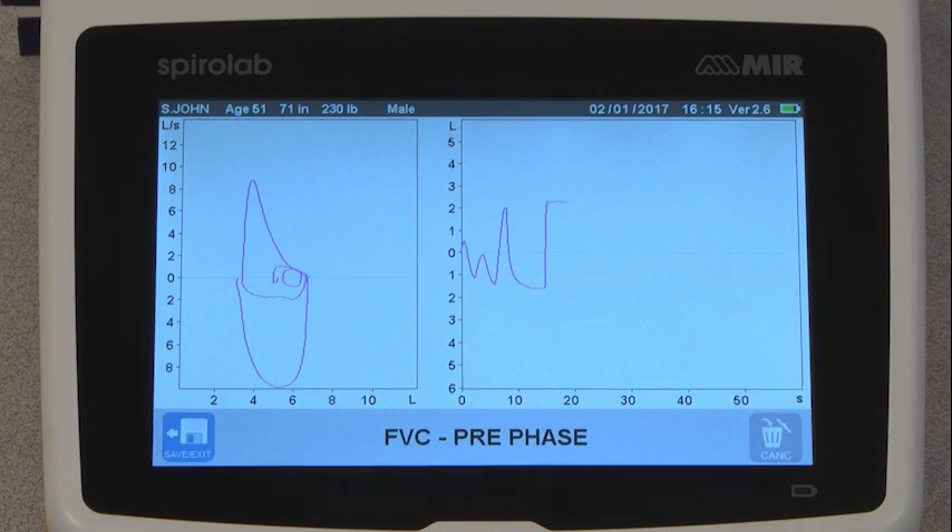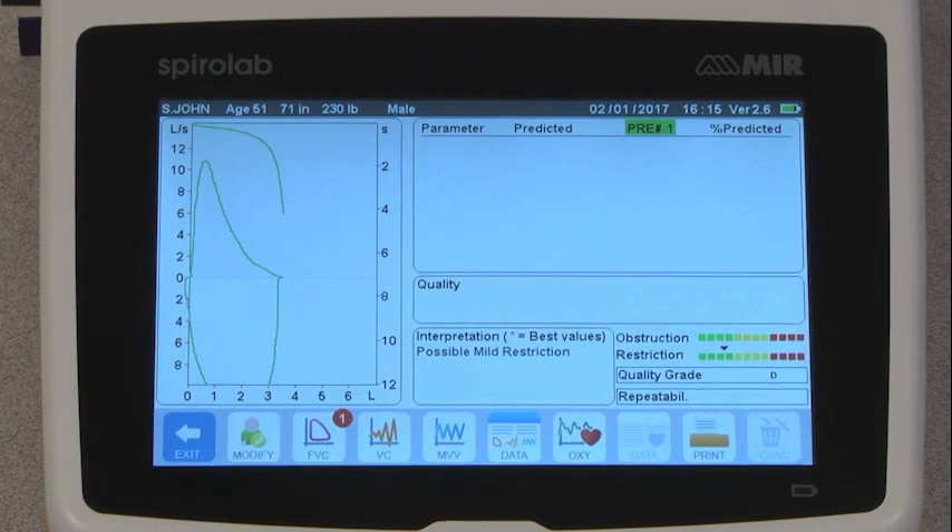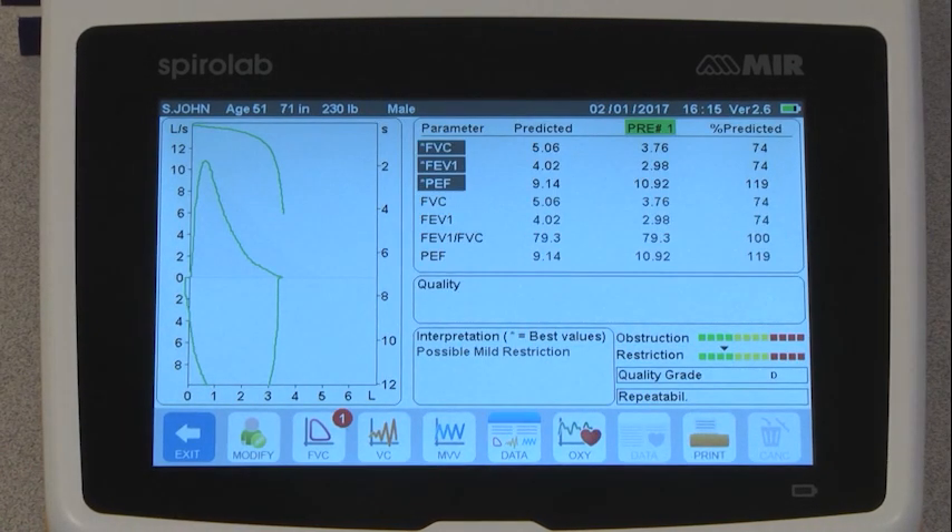When they are done, press Save Exit and you will be taken to the results screen. Here you will see the graphs, the results of the test, and the interpretation of the results.